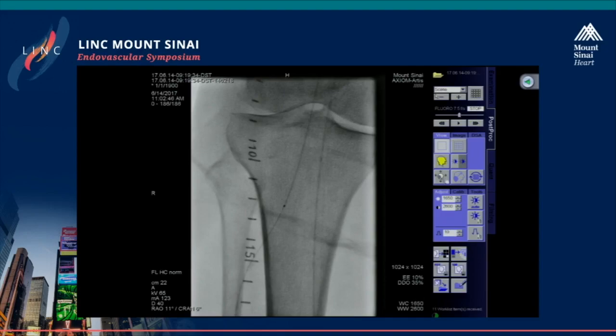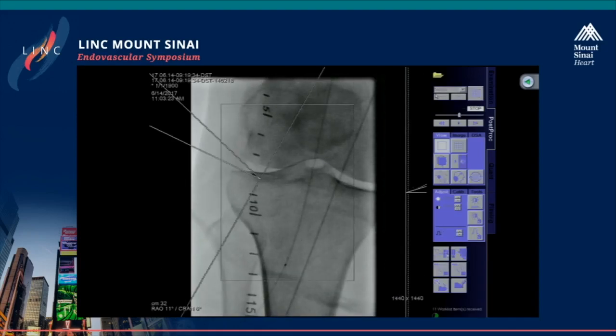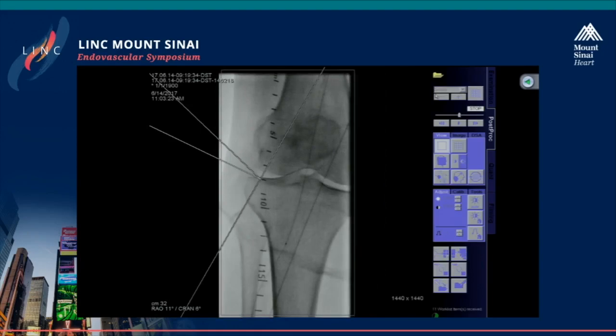So this is a 4.0 chocolate, guys? Yes. It's a 4.0 chocolate balloon. And for those of you who don't know how the chocolate balloon works, this is a balloon that has, what length is this? 120. 120, wow. You guys went nuts. Oh, we did. So you're going to do proximal and distal, okay.